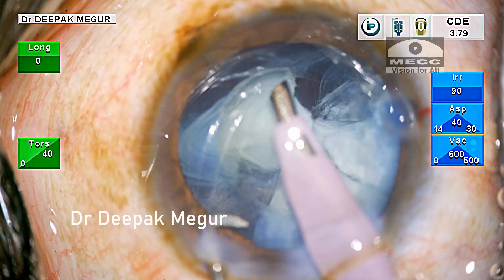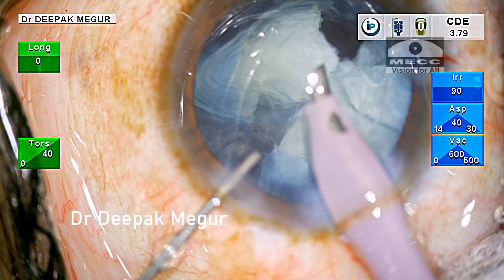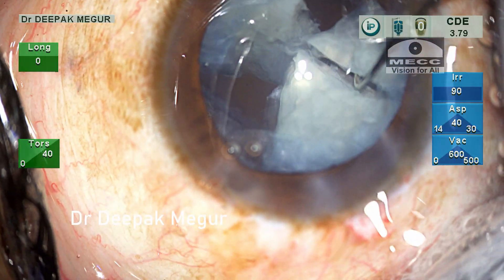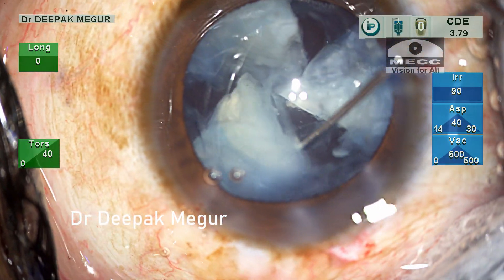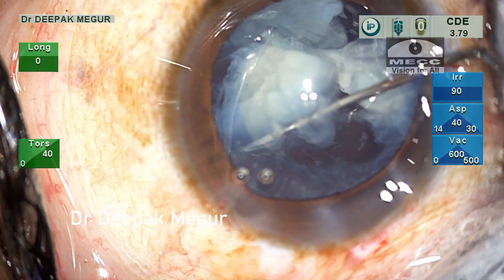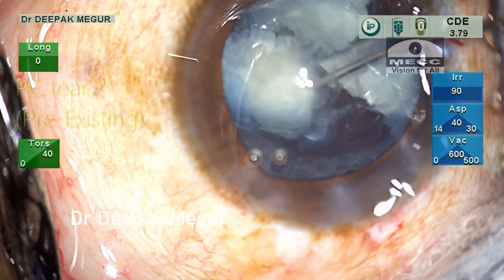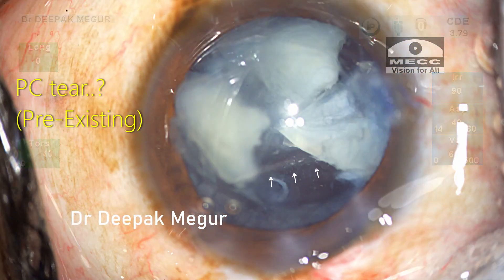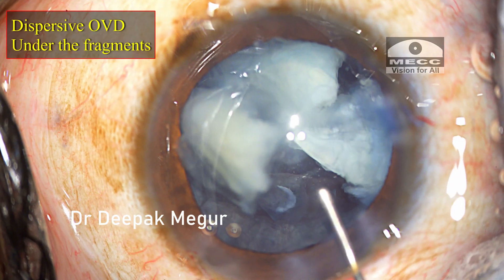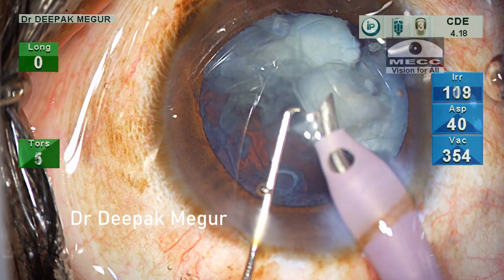The chopper comes out and I replace with dispersive OVD before withdrawing the phaco probe. Now is the time to inspect and have a relook. The nuclear fragments are pushed aside. At the outset it looks like there is a PC tear underneath these lens fragments — probably a pre-existing one. Dispersive OVD is pushed underneath the fragments and with the cushion of this dispersive OVD, I am continuing with phaco emulsification.